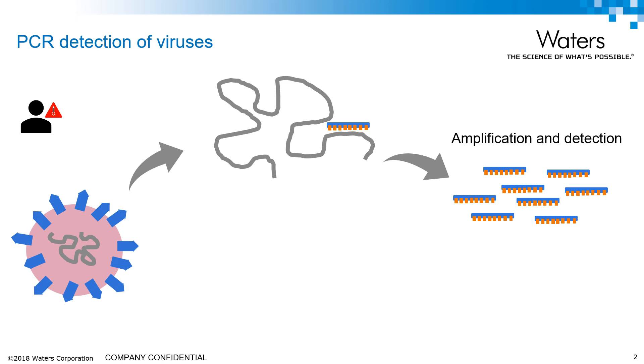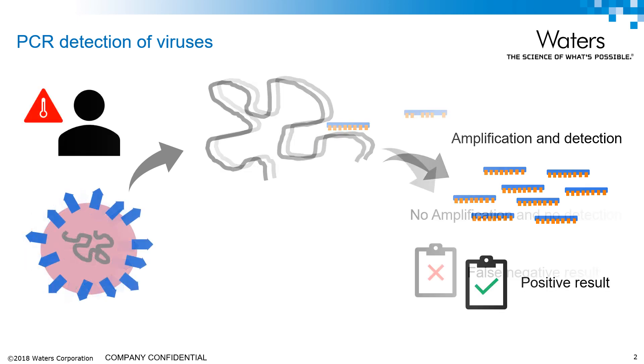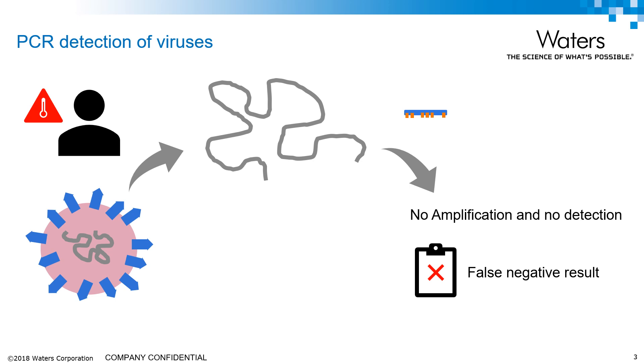If the gene is present and so the virus is present, we get a positive result. However, if there's a problem with the primer, the primer doesn't bind to the gene and we get no amplification and no detection. In these cases, if it was an infected patient, we get a false negative result.